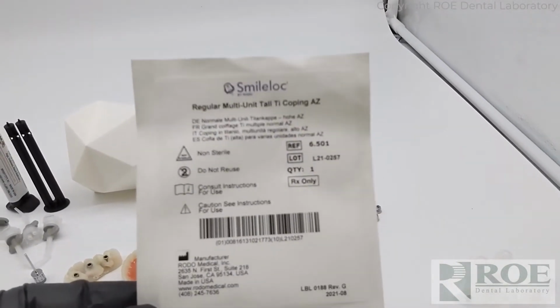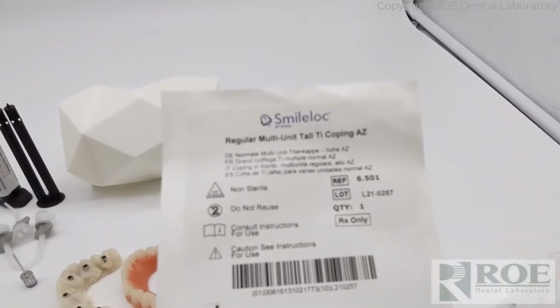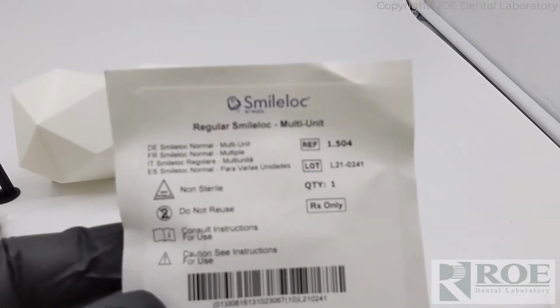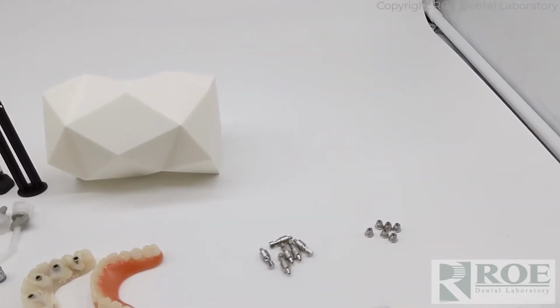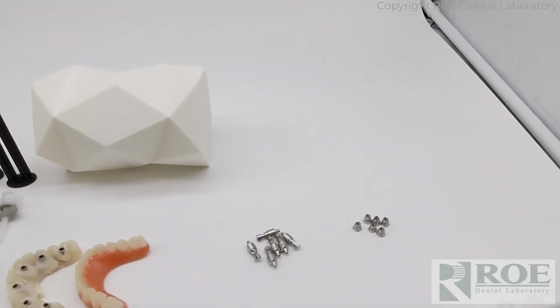All of these components, these parts, all come in basically surgical packages. They are not sterile, but this is the kind of package they'll come in. So this is a tall coping. This is the multi-unit abutment package that'll come in. The analog.